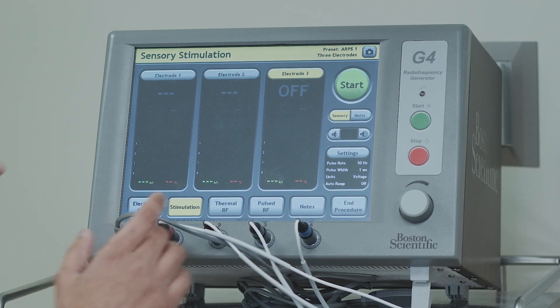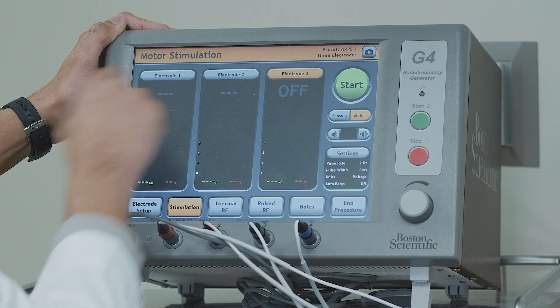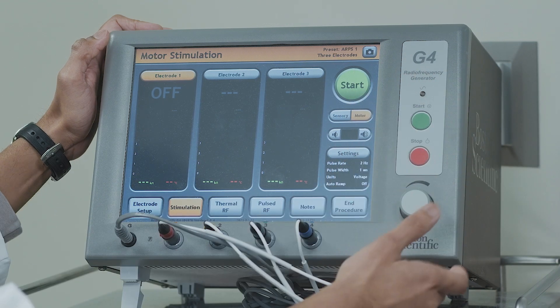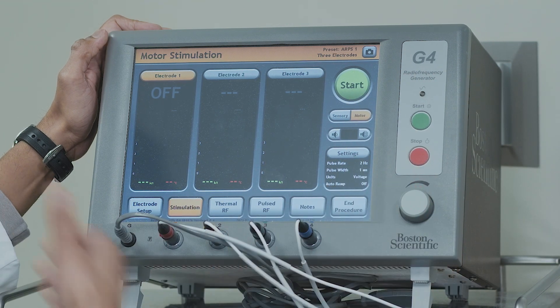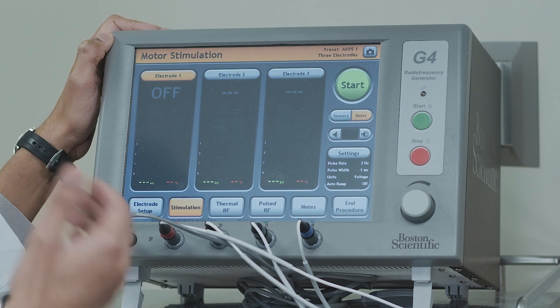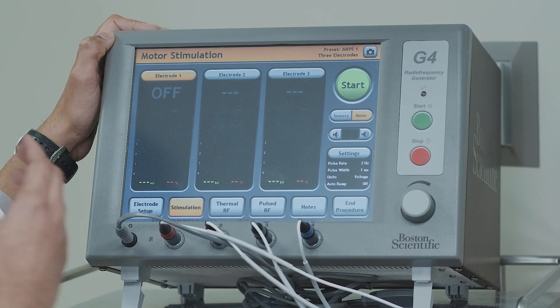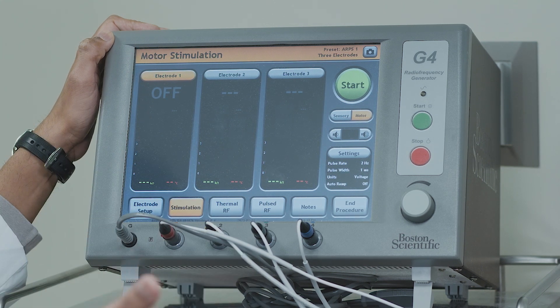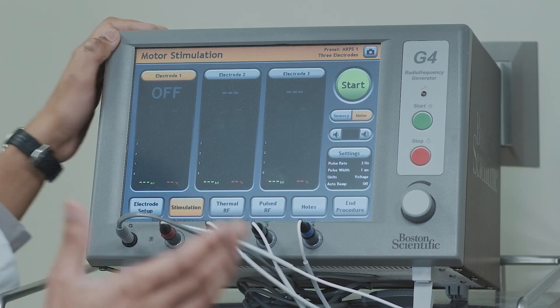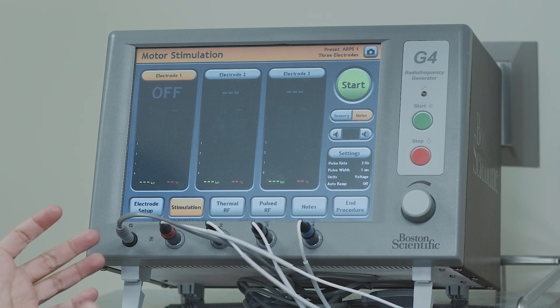The next piece is motor testing. We go through all three electrodes again, turning up the stimulation, and the patient feels a twitch or tap. We want the patient to feel the twitch or tap in the back — not in the leg. When the patient does not feel the twitch or tap in the leg, we know that the needle is away from the branches that allow you to move your legs, and that's how we preserve motor function.